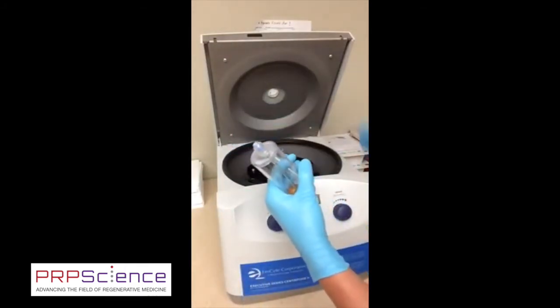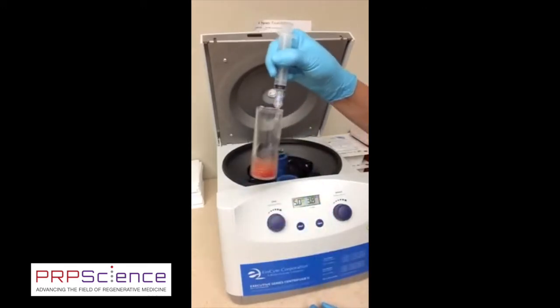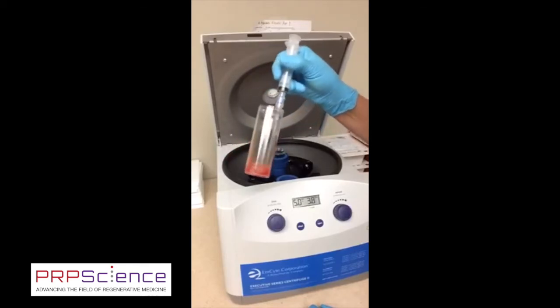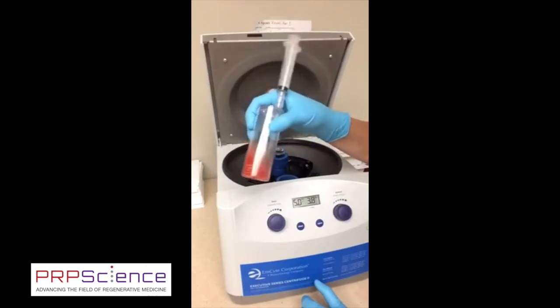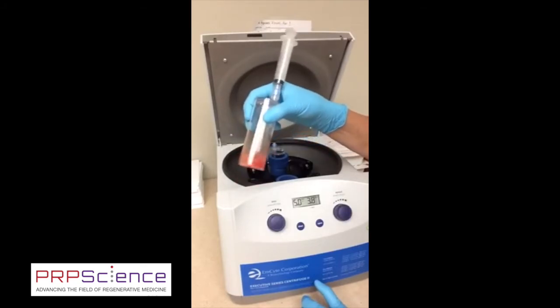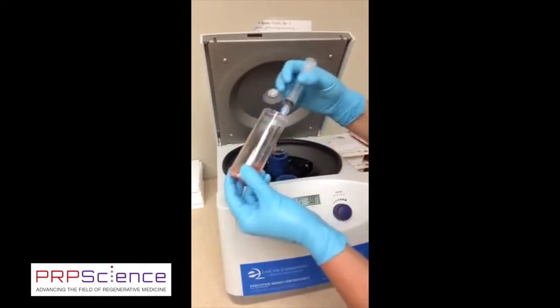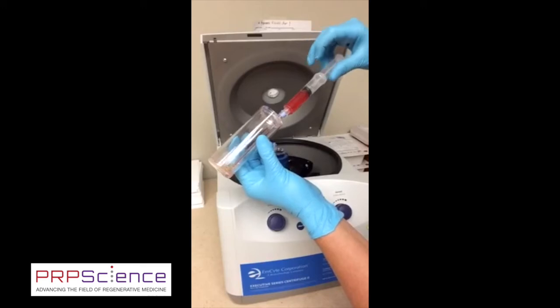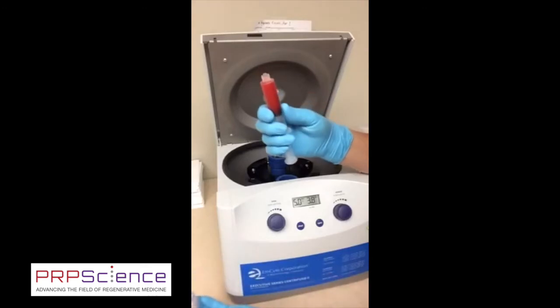Then I'm going to take my 10 or 20 ml syringe, whatever you're using. I'm going to put it on there, and I'm going to very gently shake and stir so I can resuspend the platelets in the serum or in the plasma. Okay, so once all those are unstuck, all right, now I have a very, very rich, platelet-dense product. And I can pull it into my syringe, and I can go ahead and do my procedure. All right, and I have my platelet-rich plasma.